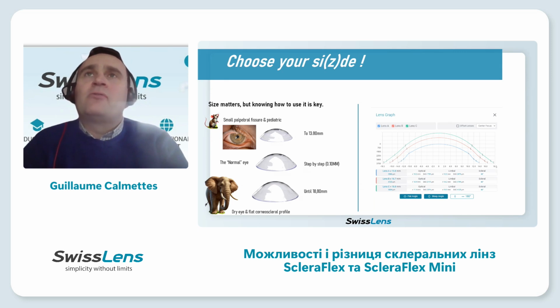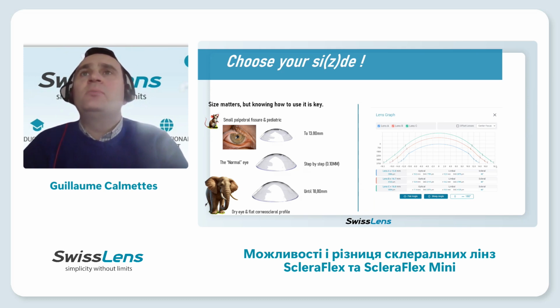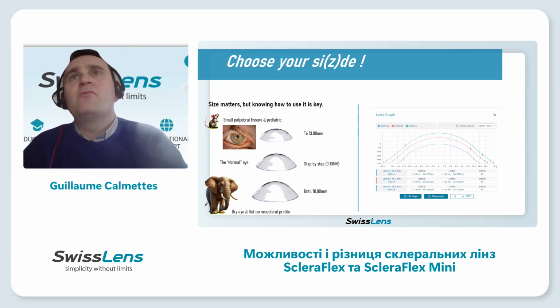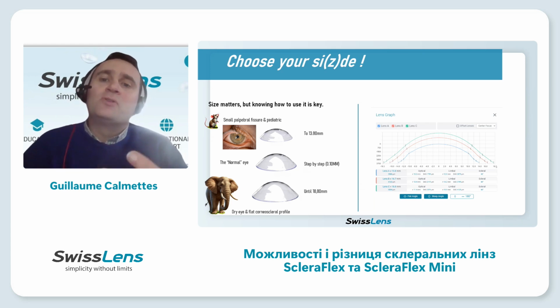On the right side of my screen, you can see a simulation screen. You can access it on the website. With that, you can understand a little bit more about how the design is evaluated when you change the diameter. So here it's the same base curve, but with three diameters. One is 13.8, one is 16.7, sorry, and the last one is 18.8. So it's something interesting to be able to understand.